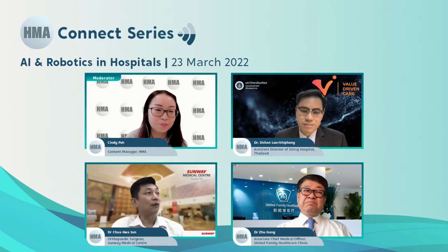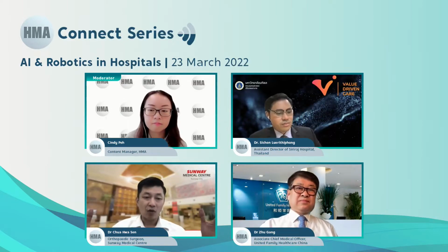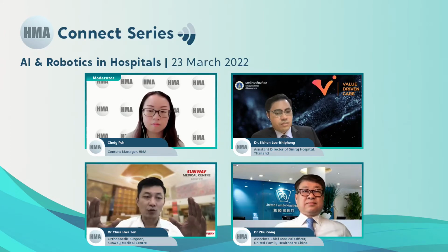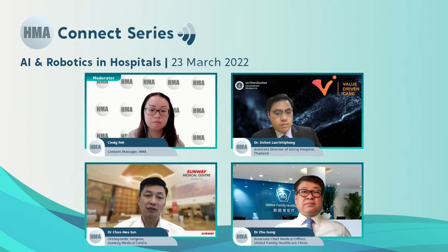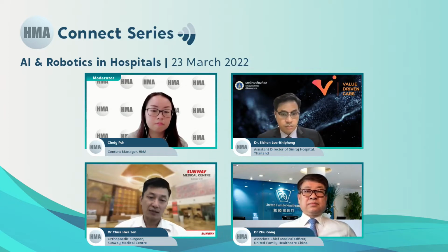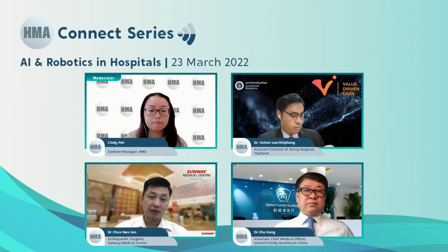I'll start first. Let's talk about robotic joint replacement. The data is out there, with and without the robotic, and there are a few things we need to look into in terms of value, or in terms of the macroeconomics. Number one, we realize that for patients the average length of stay is less, comparing conventional and robotic. That by itself already reduces the expenses necessary.